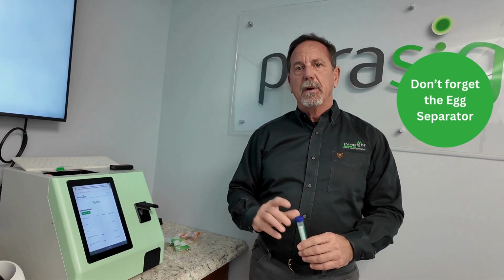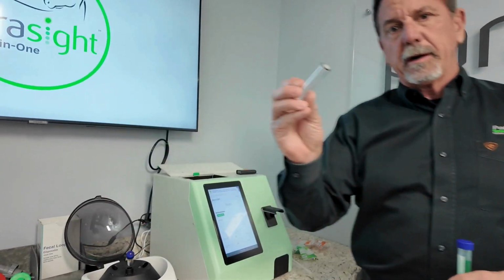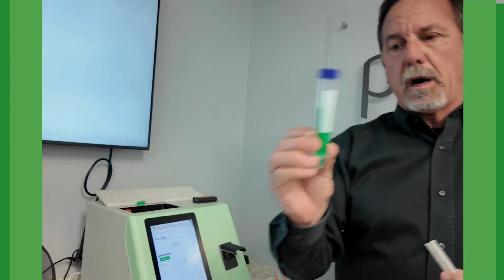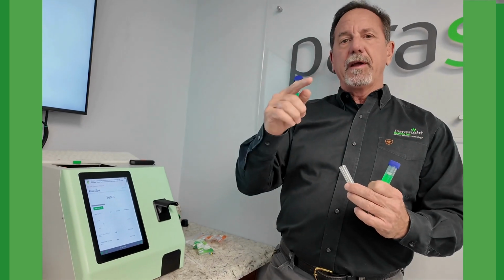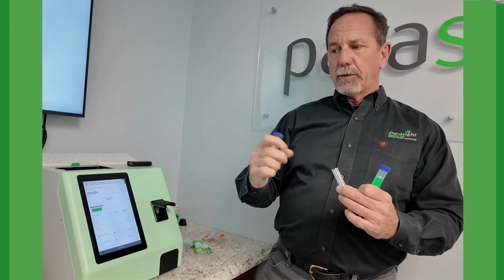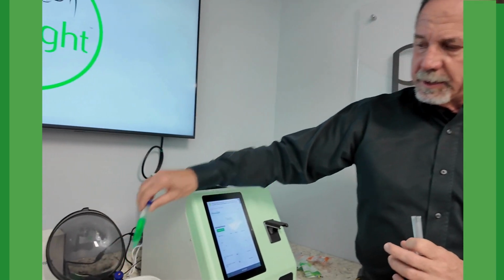Most of the time, egg chambers are clogged because we forget to put in the egg separator. If we don't put that in, it allows us to pour all of the specimen in after we spin it and overflow that chamber, and have all the fecal matter that we spun down before go into the egg chamber, and that's not what we want to do. Remember, what we ask you to do is to take it after it comes out of the 1 minute spin.